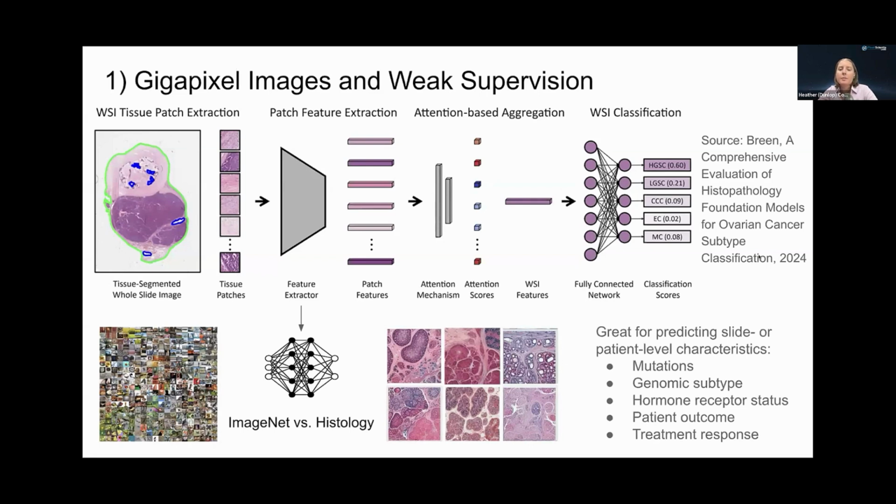But keep in mind with this approach that this information flows in one direction, from tiles to tile embeddings, then through the slide level model to make a prediction. There's no way to add contextual information to the tile embeddings. Such a model might miss out on the information that pathologists get from zooming in and out and panning around a slide.